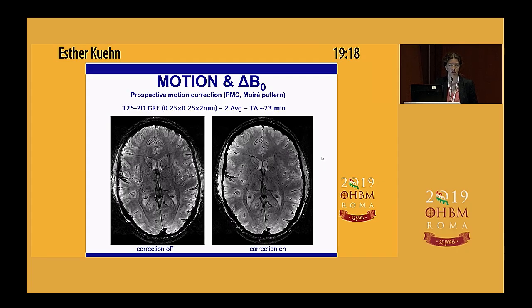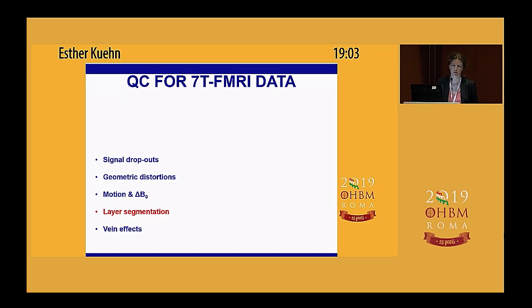The only thing that you have to keep in mind when you want to use those technologies is that you have to calibrate it before use. So at the beginning of the day, you calibrate the technique, and then you can use it for multiple subjects, multiple scans afterwards. Oh, sorry, and I also wanted to say that you can also combine this prospective motion correction with additional technologies that correct for the gradient nonlinearities. So there's a lot of possibilities also to extend this algorithm further to also correct for the distortions that are associated with the motion, as I indicated before.